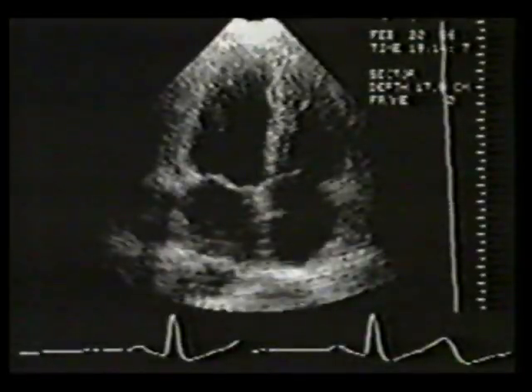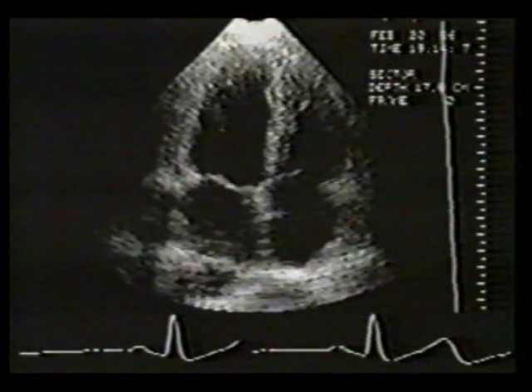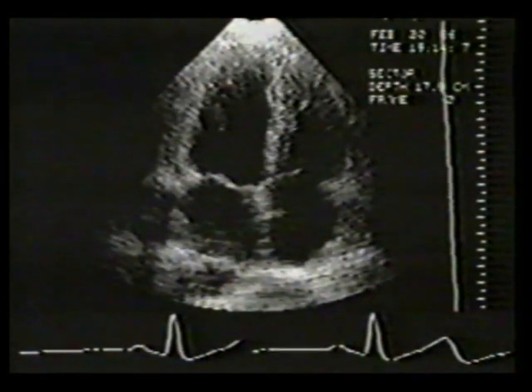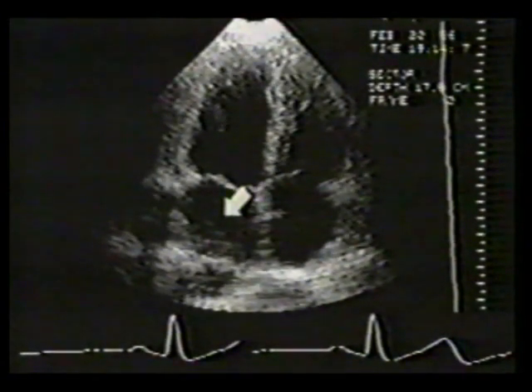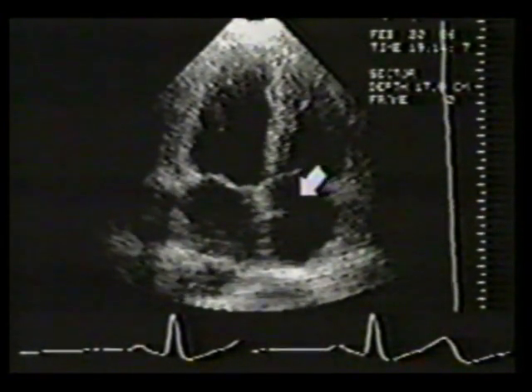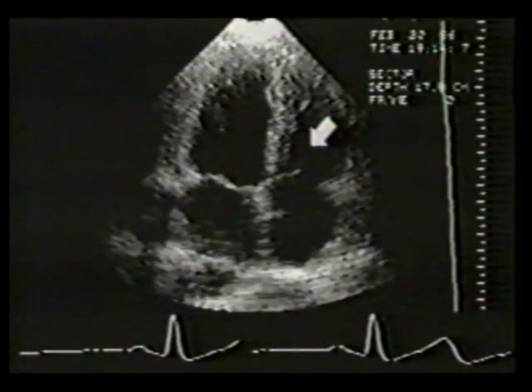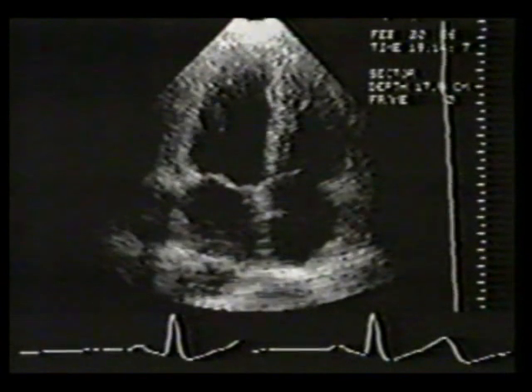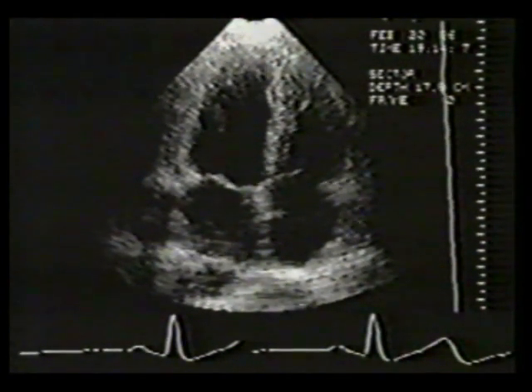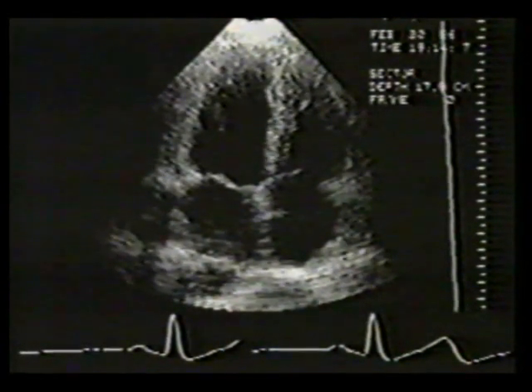Several institutions display the apical 4-chamber view with this orientation. Left ventricle and left atrium are to the left of the screen, and right atrium and right ventricle to the right of the screen. At the Mayo Clinic, we use this particular orientation. Therefore, when apex up images are displayed throughout the remainder of this tape series, you will see them in this format.